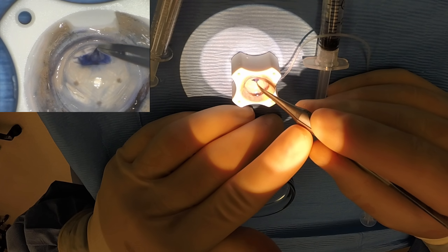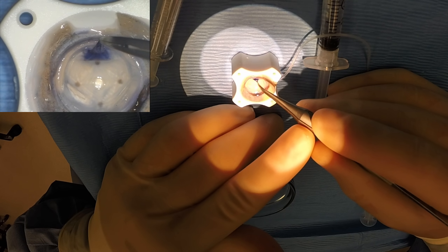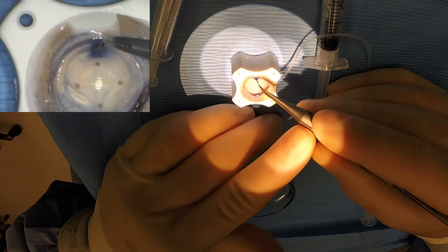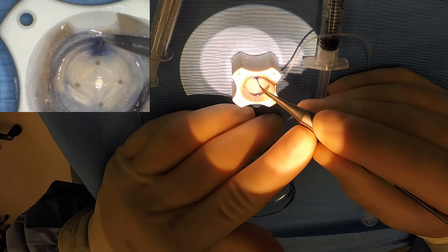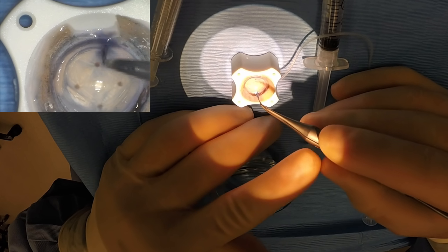I know the hinge is superior here because of the notch that's been cut by the eye bank. So I pull up and just take my time when I get to the hinge, which is the only area of the graft that has not been stripped, and gently pull it up.